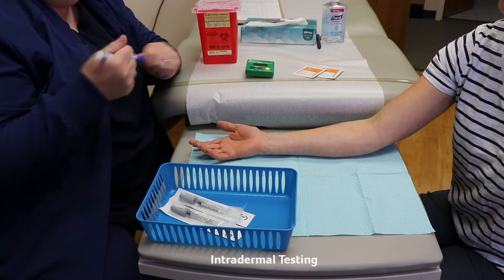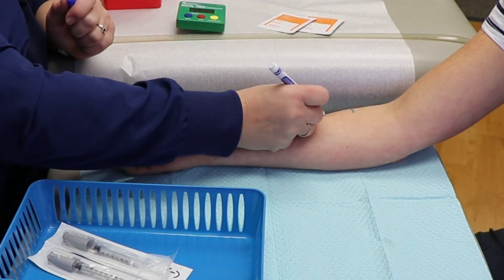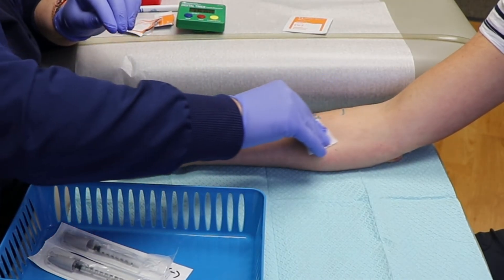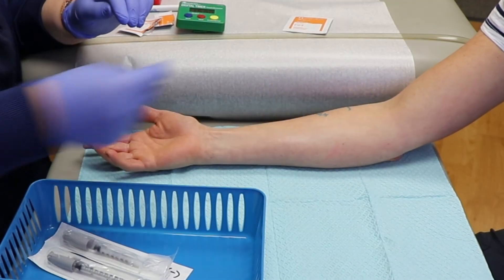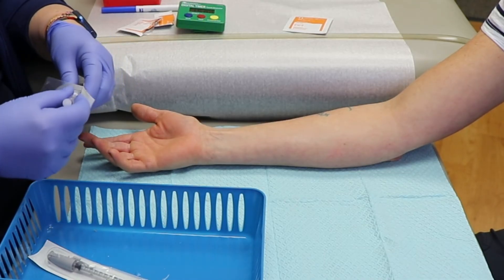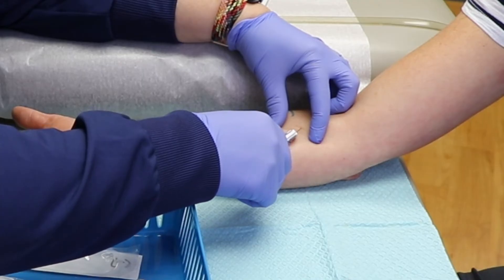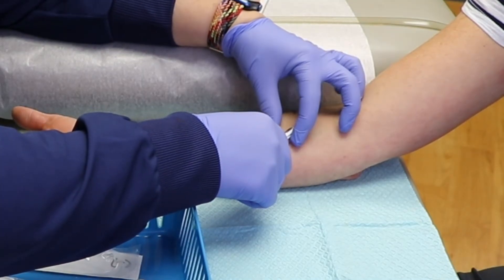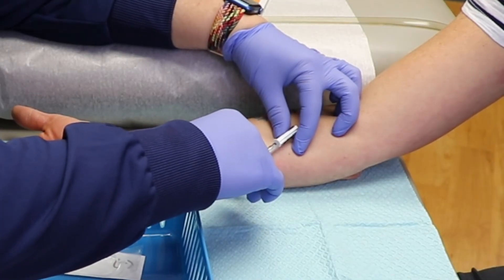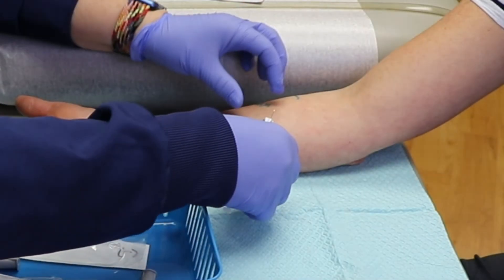If your skin prick tests are negative but your allergist still suspects you might have allergies, more sensitive intradermal tests may be used, in which a small amount of allergen is injected under the skin. This type of testing is not done for food allergies. A small needle is placed under the skin to insert a small amount of allergy serum, creating a small bleb or bubble. The testing process can sting, and it is important that the patient is able to sit without moving for this type of testing.